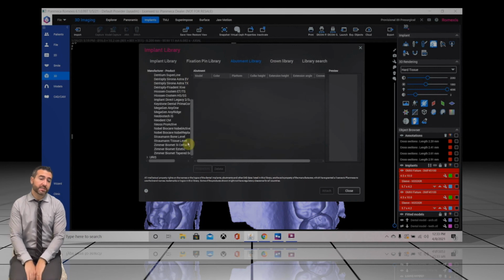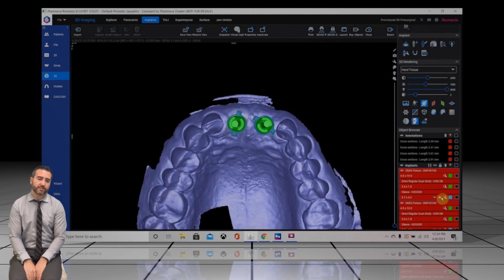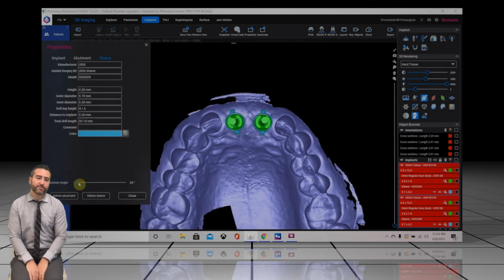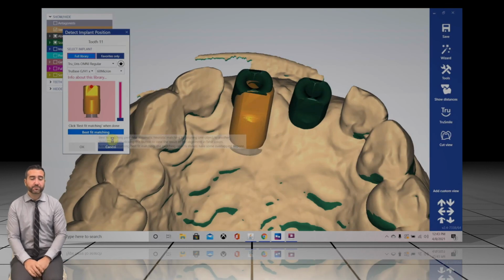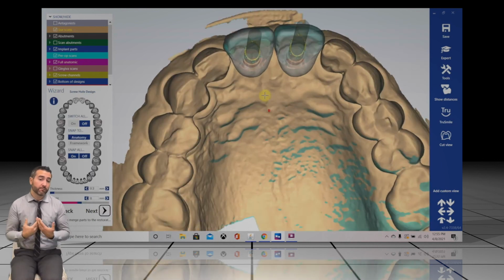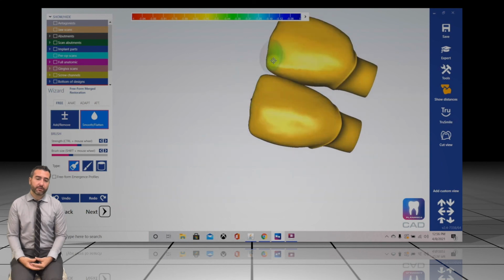Now what's cool, this is kind of unique. I'm attaching virtual scan bodies to these implants. What that's going to do is let me export everything into any laboratory software and be able to design prosthetics from this plan. So here we are in PlanCAD Premium, which is basically customized exocad. And my digital wax up, I'm able to cut holes right in my digital wax up. Remember, we haven't even placed these implants yet. So here's my wax up here. Those are my final prosthetics that will slide onto my tie base.